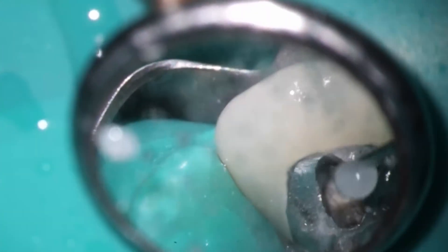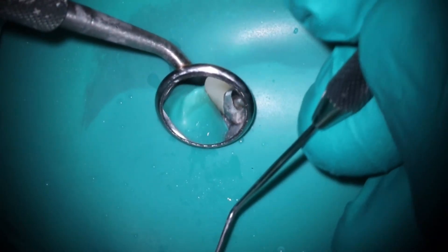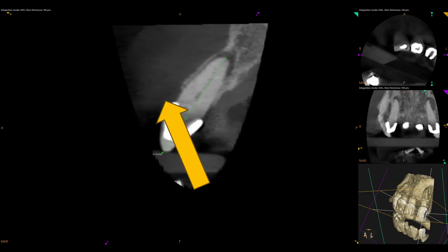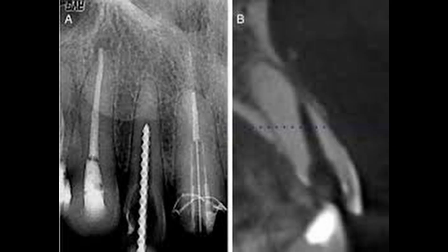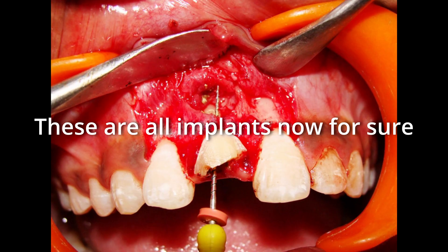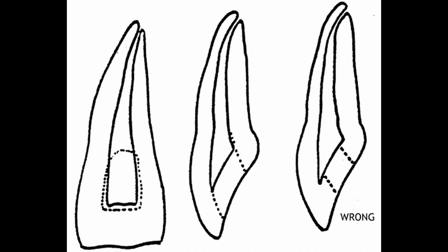What you'll see here is that this is where the long axis of the tooth is, and they actually came and almost went out the buccal. This is a really common thing and you see it all the time in the literature where perforations always occur to the buccal — that's what these photos are showing. This is usually when I have to repair perforations for the anterior: they go out the buccal.